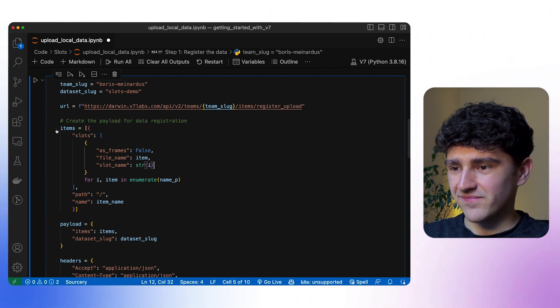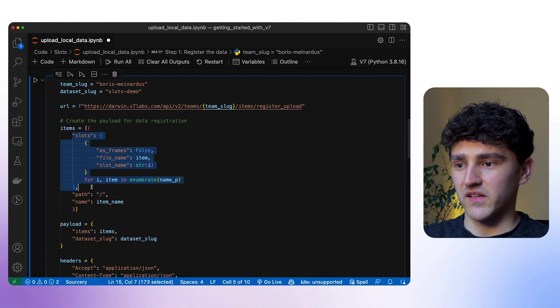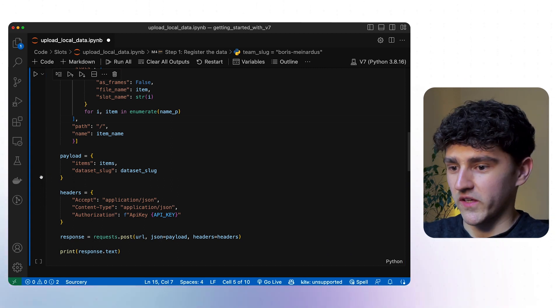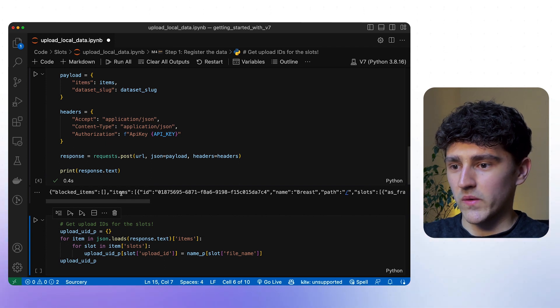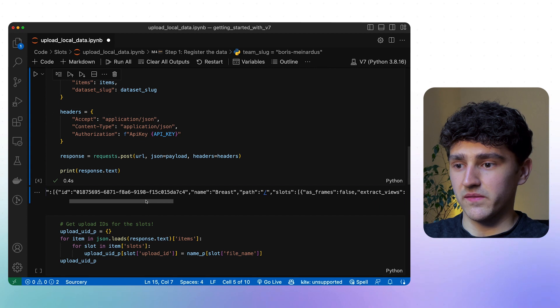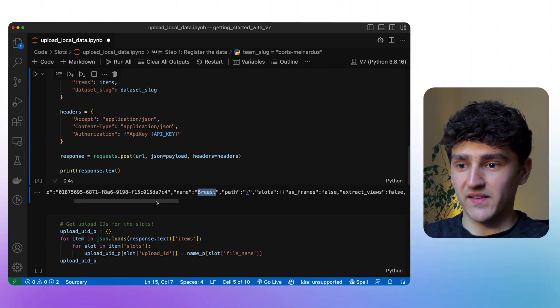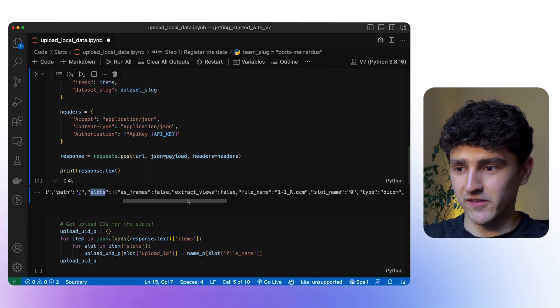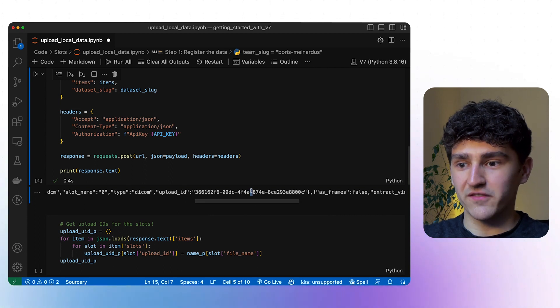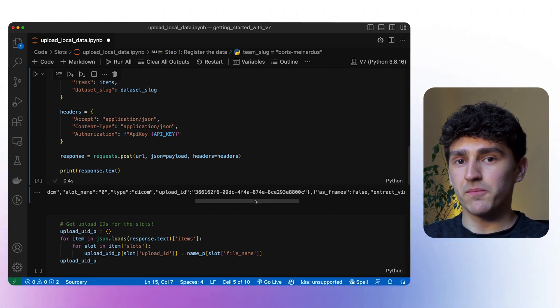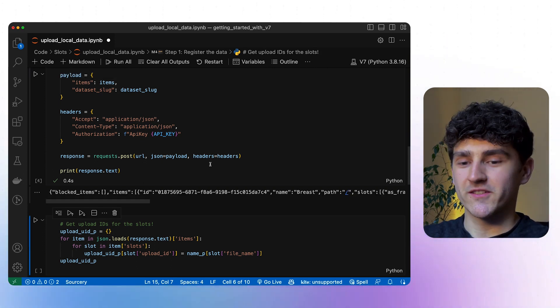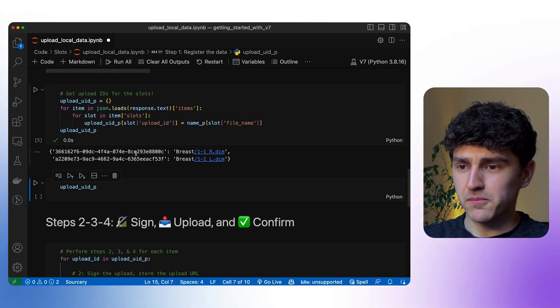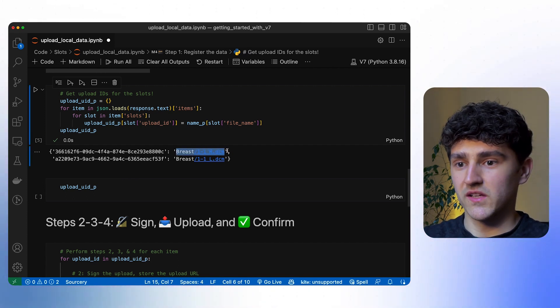After building this payload, we send our request and receive a response listing all the items we want to upload. In this context, it's going to be one item called breast, but this one item will have multiple slots — multiple actual images in those slots. Each individual slot will have an upload ID. We then extract those two upload IDs for the two individual images and store them in a dictionary where the key is the upload ID and the value is the path to the actual item.